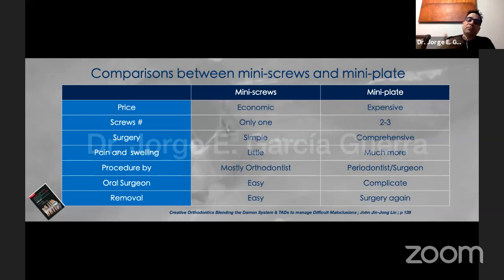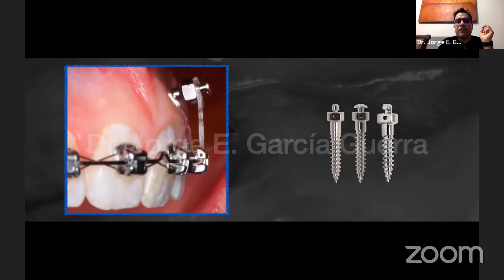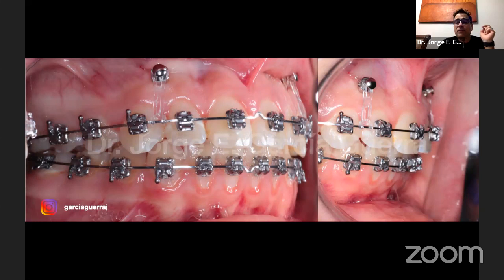Now, this is an example of a mini plate. These are screwed or anchored to the maxilla or the mandible. Sometimes we use them for orthopedic reasons, like in this case, where we use the face mask so we can do a maxillary protraction. Okay. And the mini implant is easier and a more direct anchorage, so we can move a tooth or a segment of teeth, like in this case. Okay. Now, you can use any kind of brackets, any kind of appliances. The important thing here is to understand a little bit about the biomechanics of the movement.